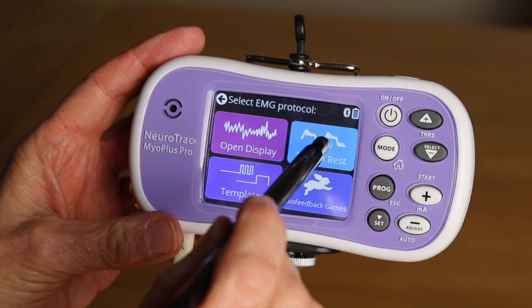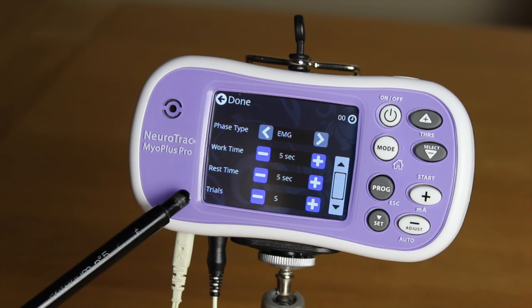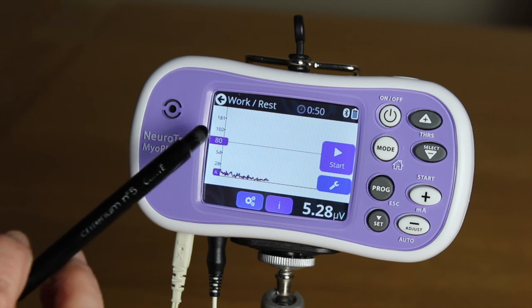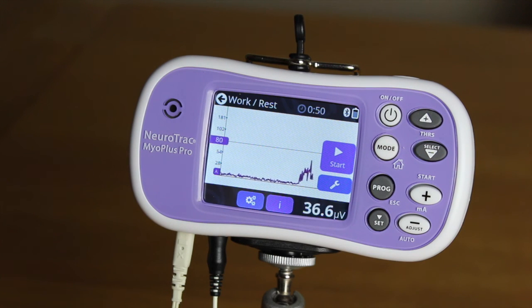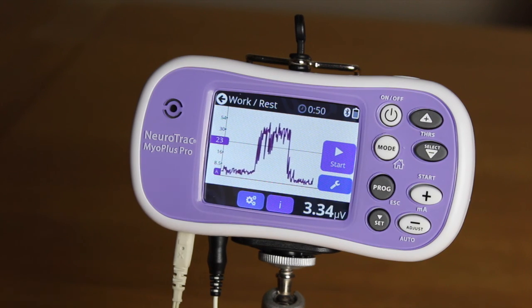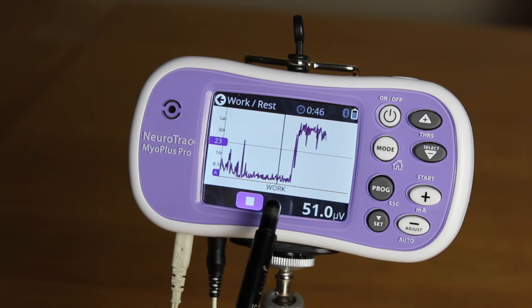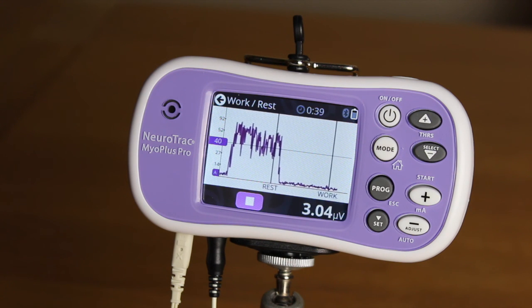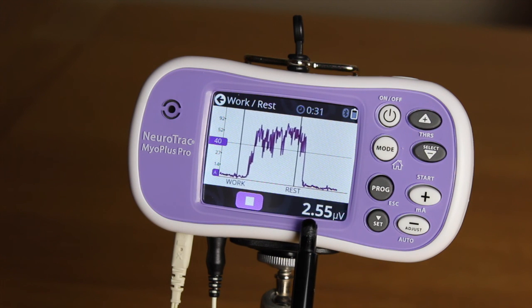You are now ready to do a simple work-rest assessment. You can customize the program, but a suggestion is five seconds work, five seconds rest, five trials. Looking at the screen you can see how the threshold is set to the last adjustment. This can be changed at the start of any work-rest assessment by pressing the auto adjust button as before. Press the start button to commence the work-rest session. The screen and vocal cue will prompt you to contract and work for five seconds and to rest and release for five seconds.